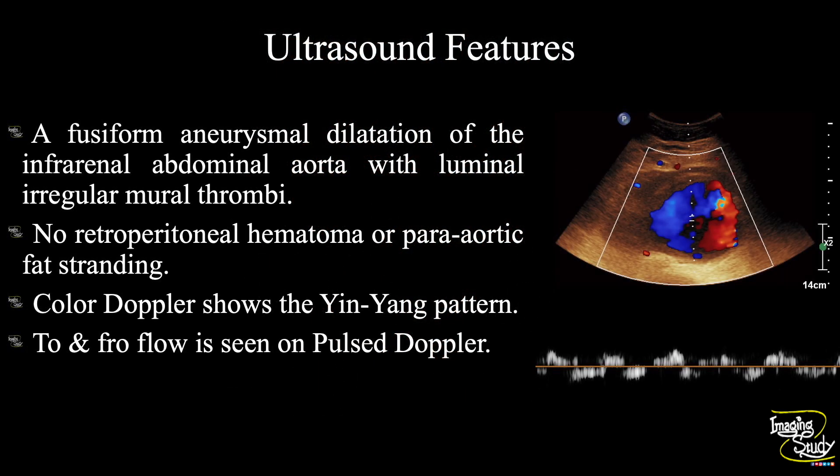In summary, a fusiform aneurysmal dilatation of the infrarenal abdominal aorta with luminal irregular mural thrombi was noted. No retroperitoneal hematoma or periaortic fat stranding was seen, which excludes the chance of rupture. Color Doppler shows the typical yin-yang pattern or Pepsi sign, and to-and-fro flow is noted on pulsed Doppler.